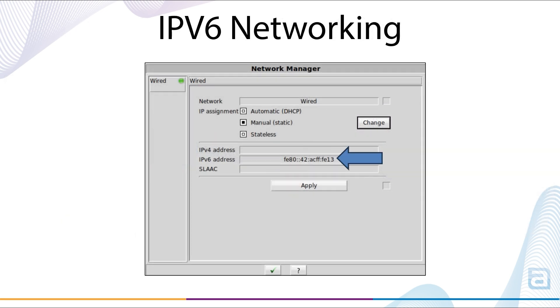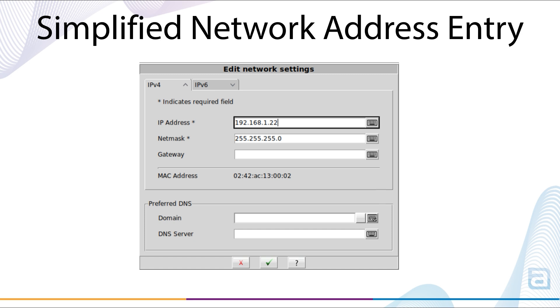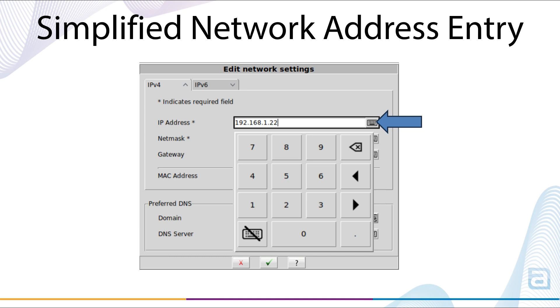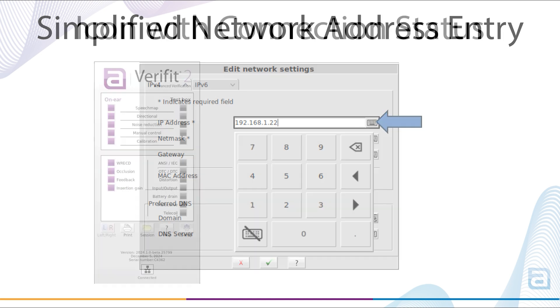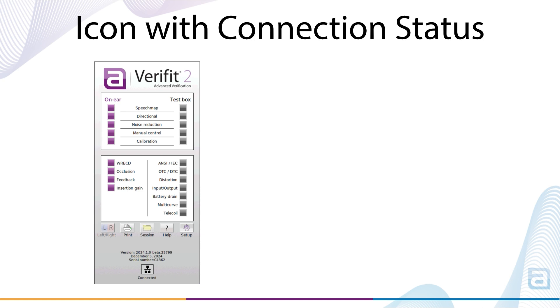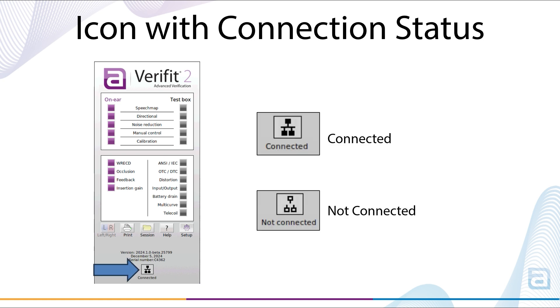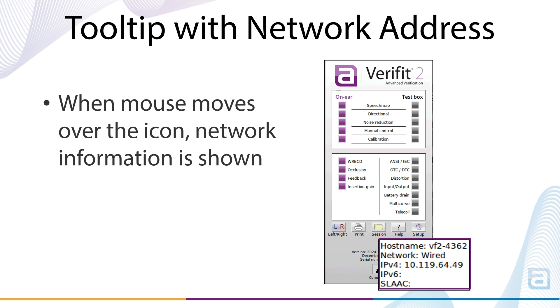Once connected via IPv6, the address provided will be a series of letters and numbers with additional characters relative to an IPv4 address. When an IP address is manually configured as a static address on the network, entry is now via an entry pad to simplify inputting network address details. The entry pad is available for both IPv4 and IPv6 network address entry. To identify whether a network connection is active, an icon on the home menu shows whether the network is connected or not, and hovering the mouse over the icon will display a tooltip indicating whether the connection is wired or wireless, and the network address information.